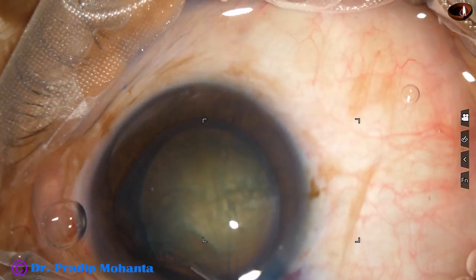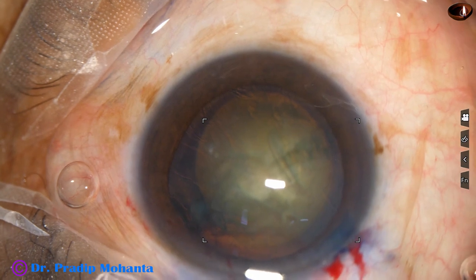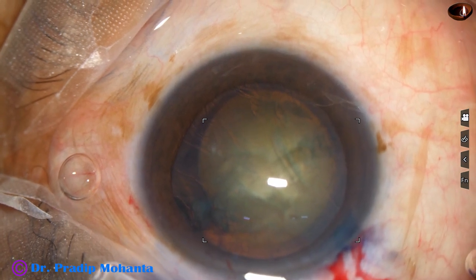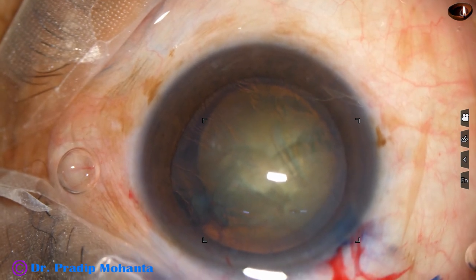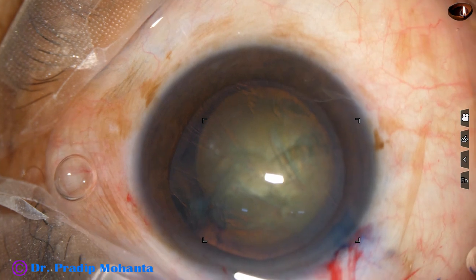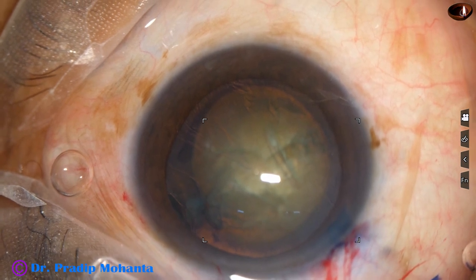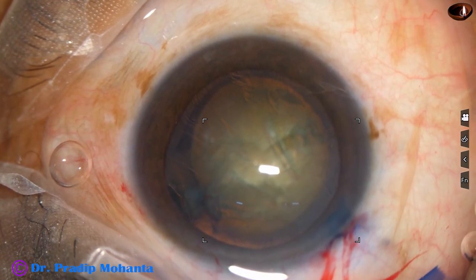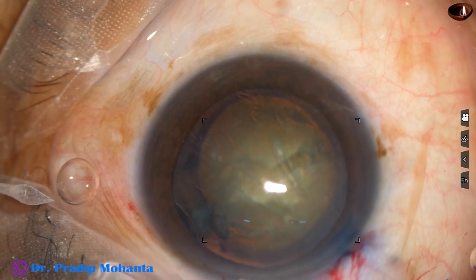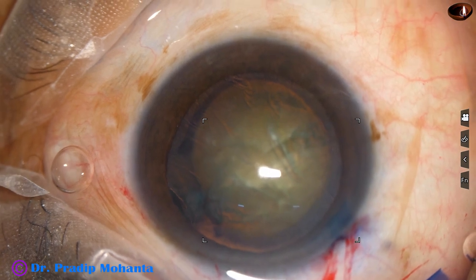There is a suspicious area at 2 o'clock and now we can see there is a red glow at 2 o'clock. The main wound is at 10:30 o'clock. I did not know there was zonular dehiscence. It is a small dehiscence, and the side port has been made right at the site of the zonular dehiscence. I have decided not to use this side port, so I have to make another side port.